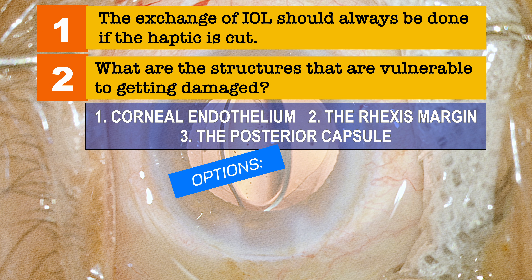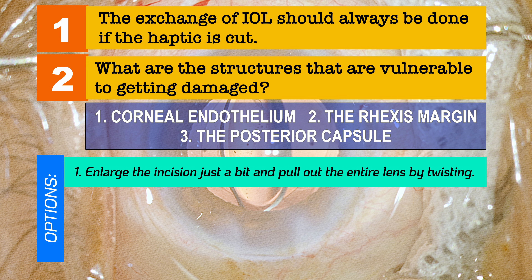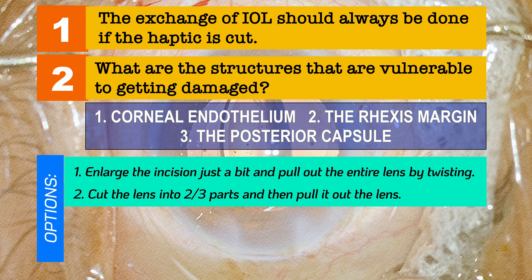What are the options available? The first option is to enlarge the incision slightly and pull out the entire lens using the twisting method — you just twist and pull it out. This may be tricky with a hydrophobic lens that is bulky and rigid. In softer and thinner lenses it is quite possible. The second option, a traditional one, is to cut the lens into two or three parts and pull it out.